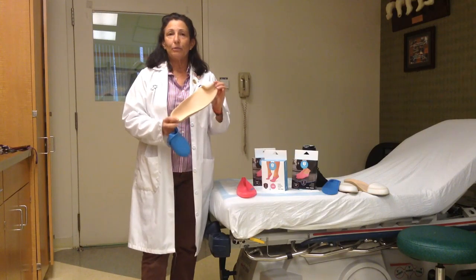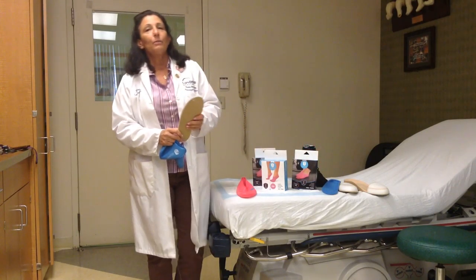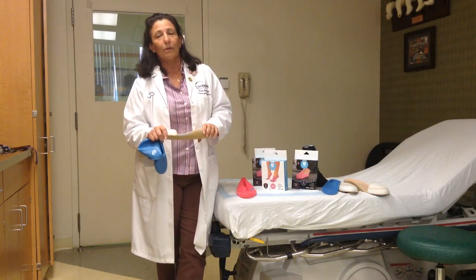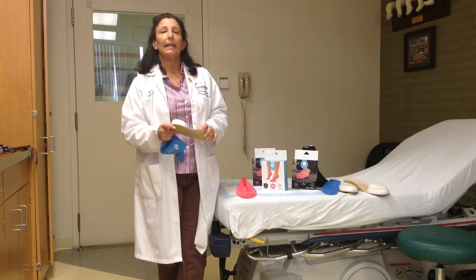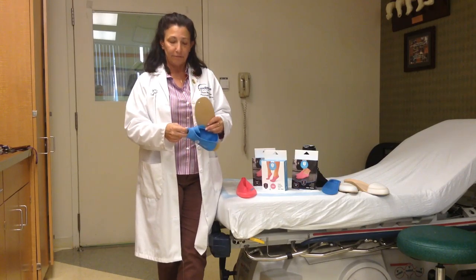This is a custom toe filler, as well as some of these others that I've put out here as an example. As we all know, it's very important for patients who have custom orthotics to wear them for much of the day. However, when you come home, you want to get out of your shoes, you want to have a little bit more air circulation, and just a more relaxed feeling.